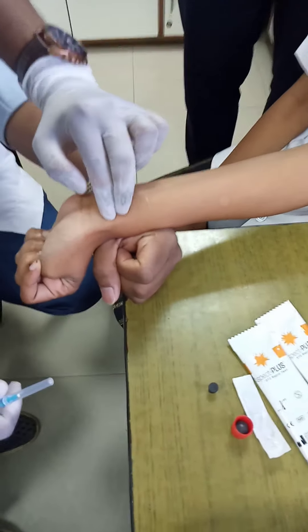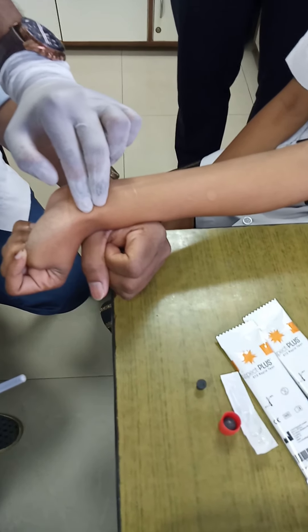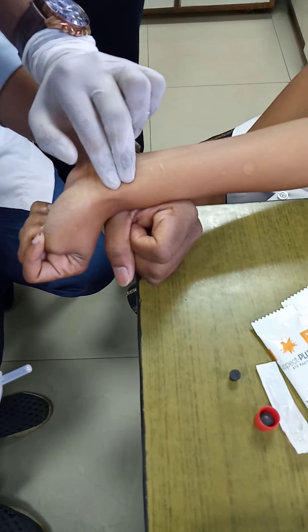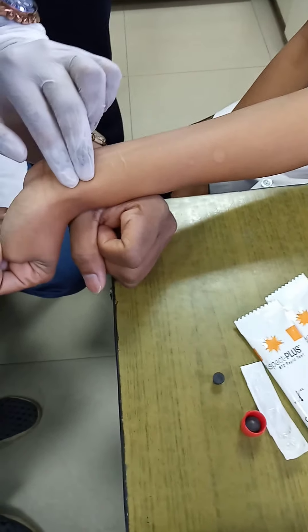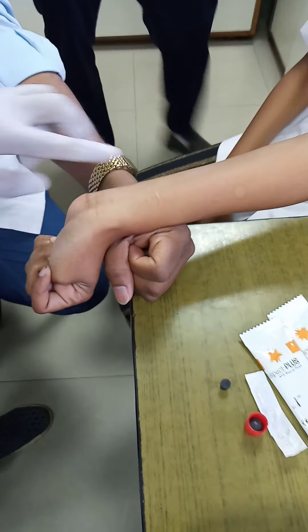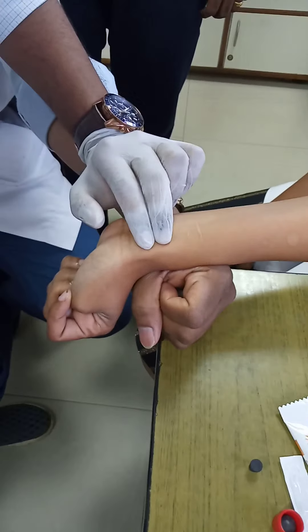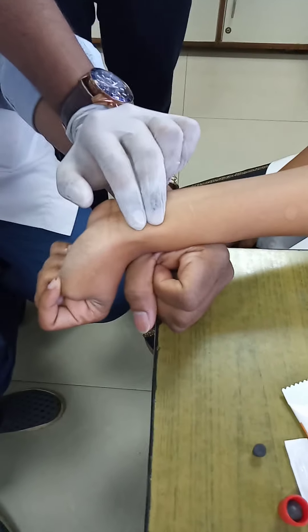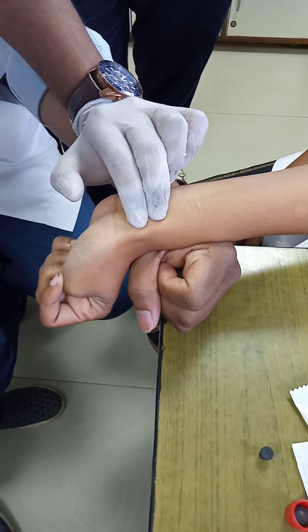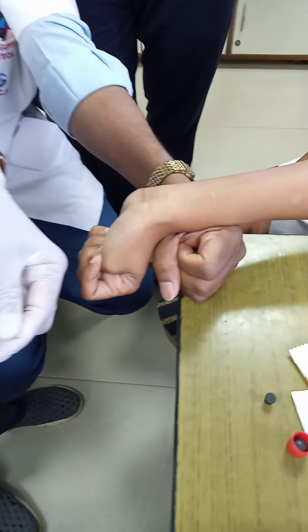The operator is still checking pulsations and not yet confident about where to prick. Arterial blood gas is a very difficult and painful collection requiring great care. The radial artery is just below the thumb, but the vein is also quite near, so there can be a venous collection — therefore you have to be double careful.